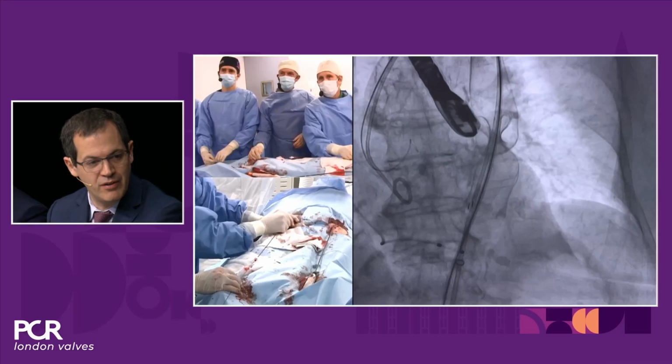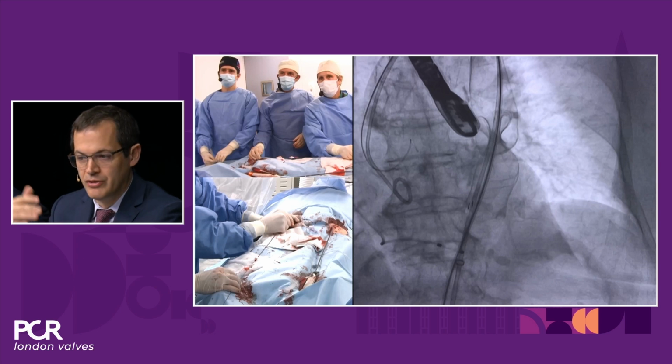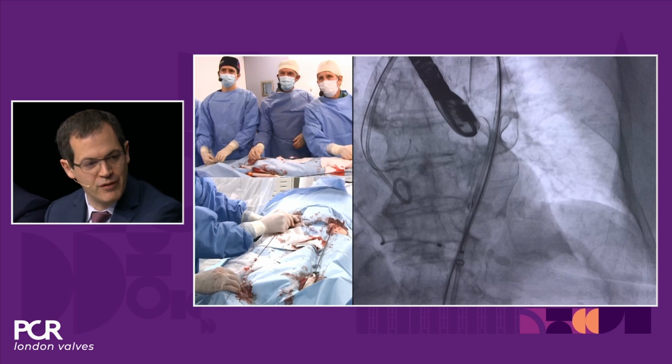One of the questions that always comes up with any arch-based device really is can it move, and is that an issue? And one nice thing about this device is it's a double layer. It almost feels, I wish we had one to pass around, it almost feels like a fabric more than a metal. And you get the sense, and you saw even with the pigtail, that there's a teeny bit of shifting. The port opens, it moves, but it feels very, very safe. Even if there's some movement, you don't lose capture. It's a very safe, controlled feel, and you can easily maintain capture, or coverage, throughout.